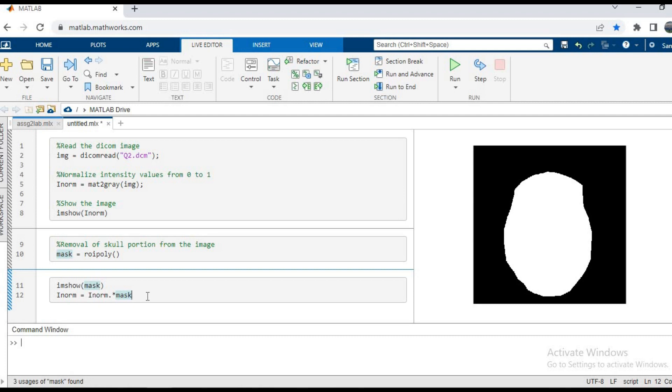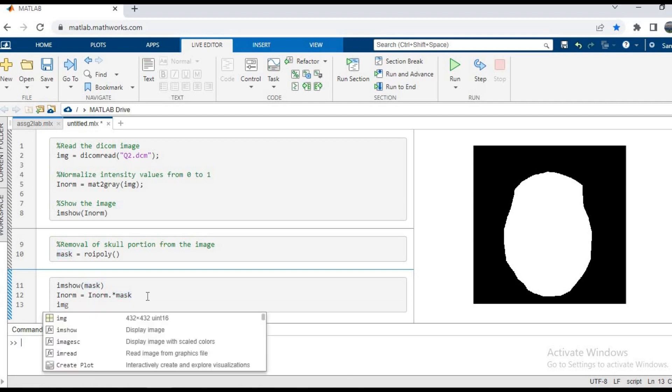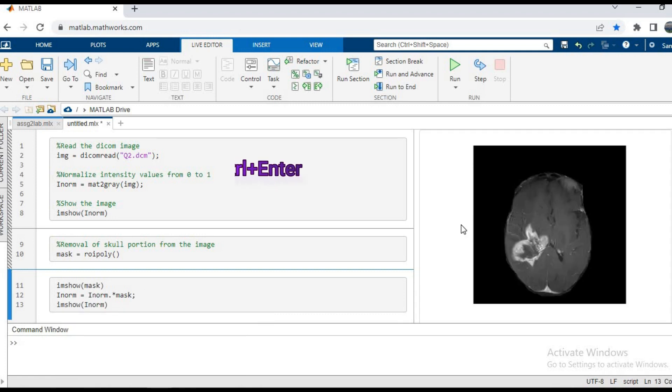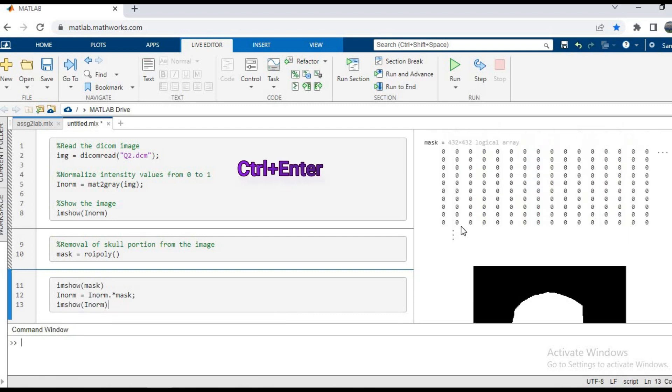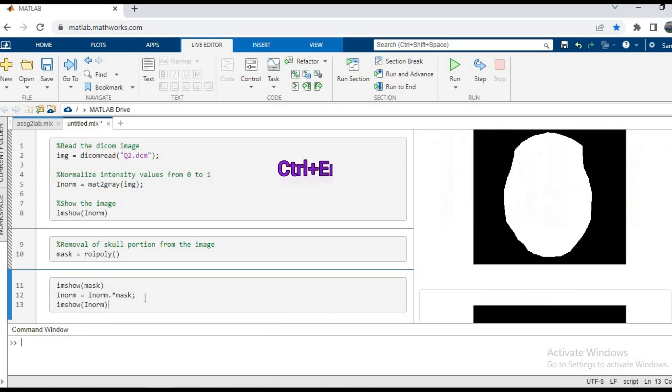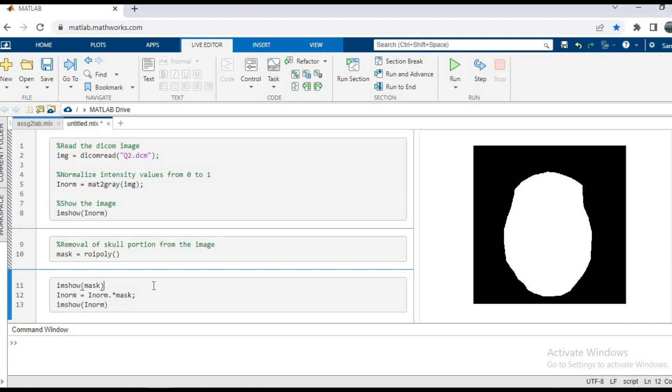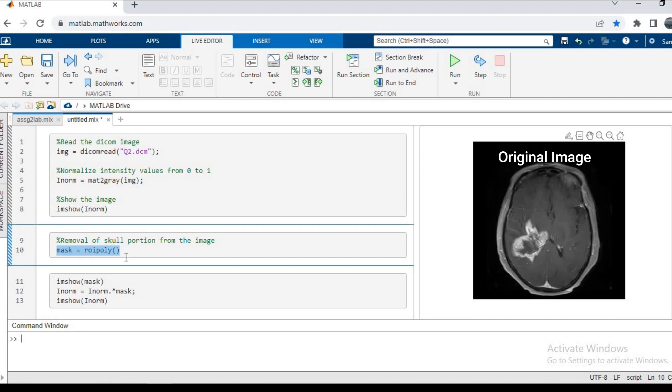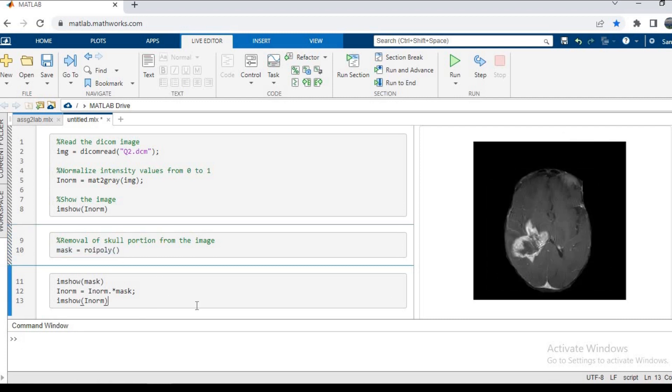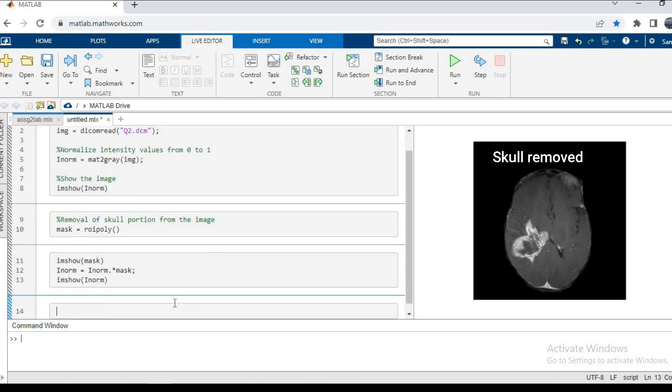In the last line I will write imshow inorm and press Control+Enter. As you can see, this is the image without the skull - the brain tissue has been separated. This was the image which had the skull, and now this image is being seen without the skull. We have finally removed the skull from our image and it's ready for processing.